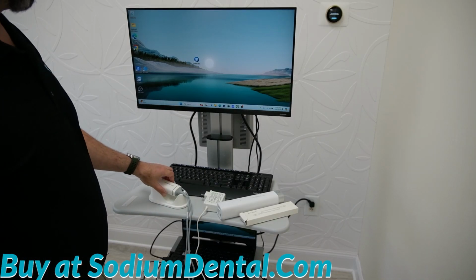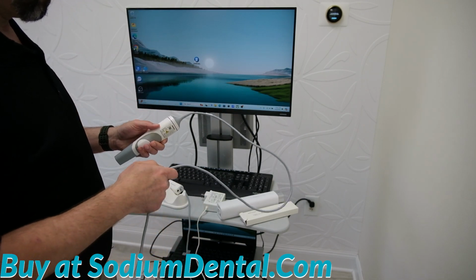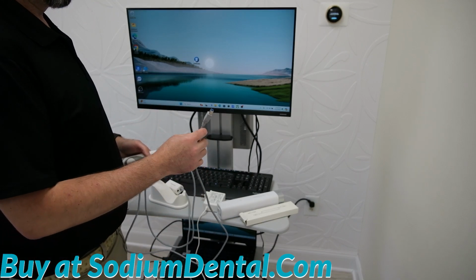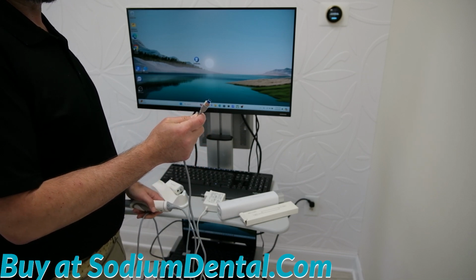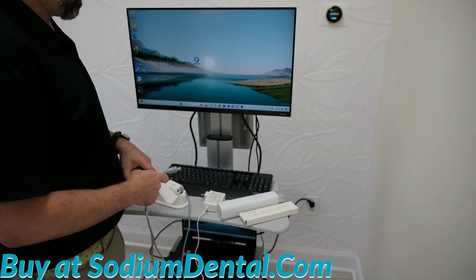Setting up your wired Aoral Scan 3 intraoral scanner. First, you have your scanner. Here is the tip at the end of the scanner. Now, the key aspect is this does not plug directly into your computer.